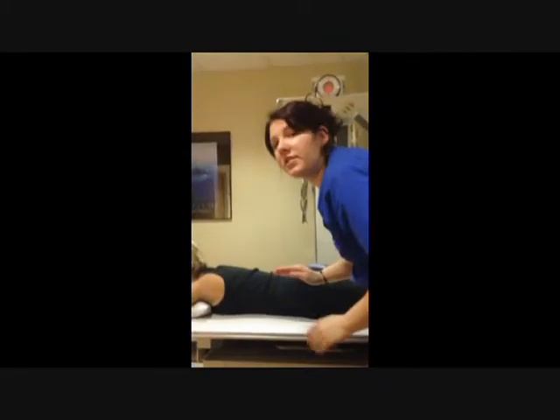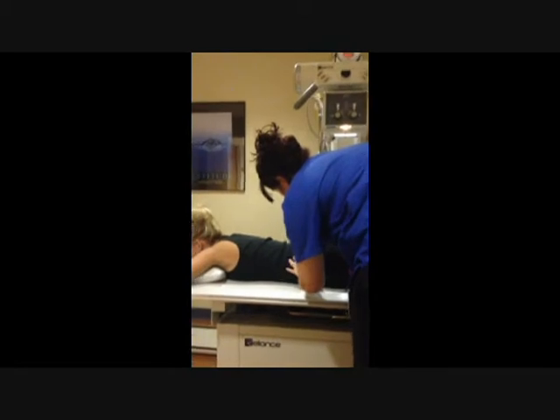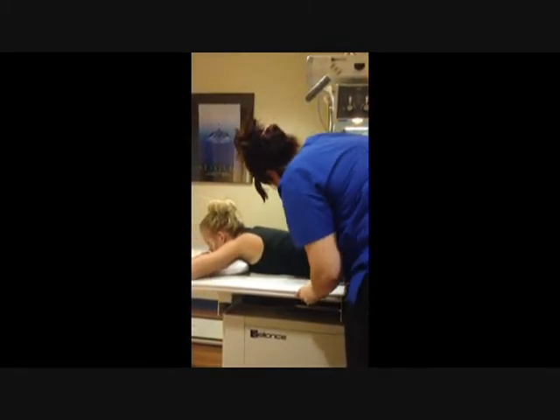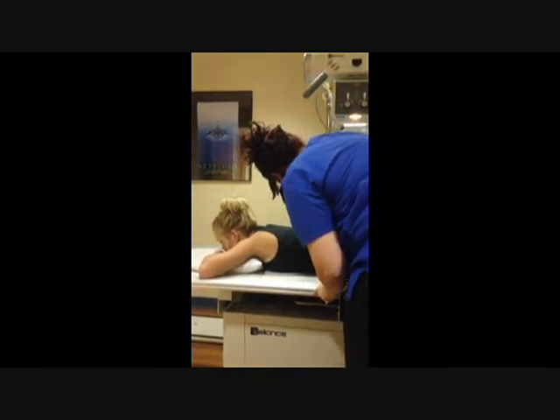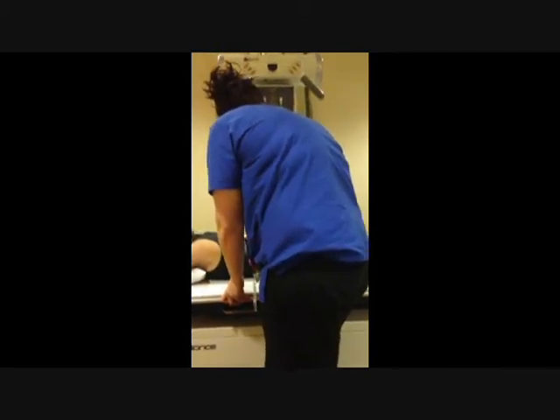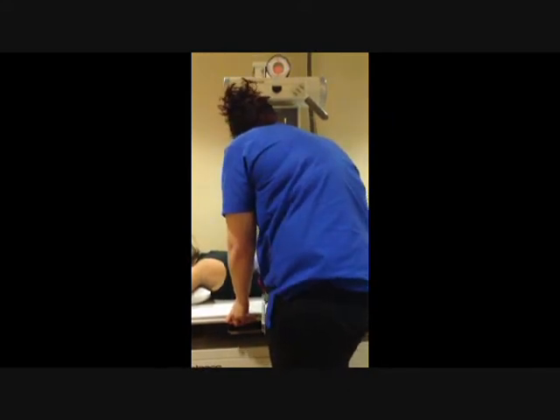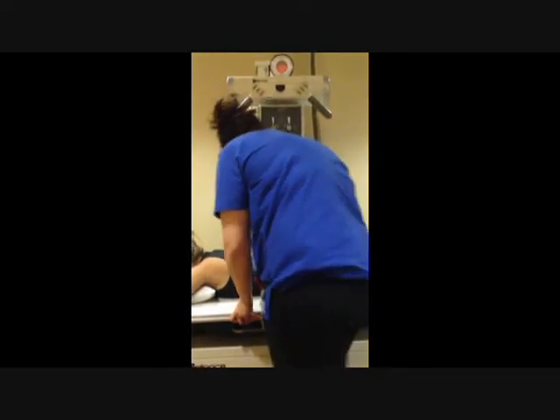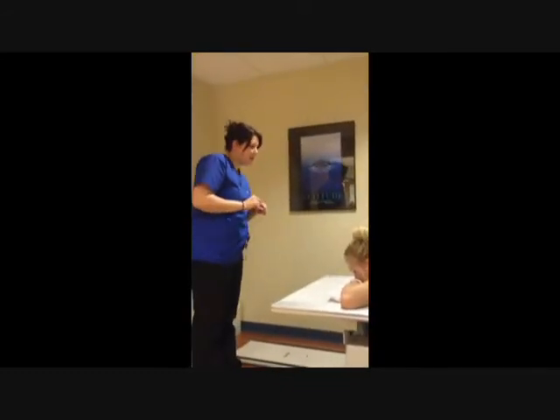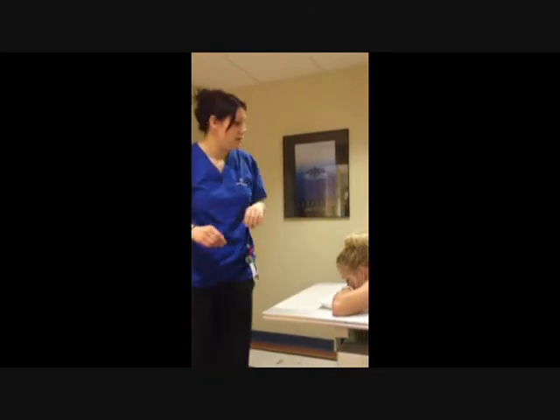And again, we're just feeling for the top of the iliac crest. For your central ray, and again, we're going to have her down just the mid-sagittal plane. You can feel for her spine for this. You're going to go up to the top of her and make sure that she's straight. She looks pretty good.